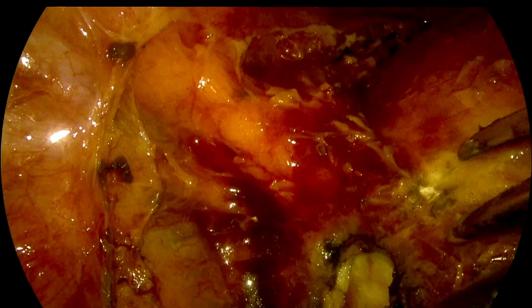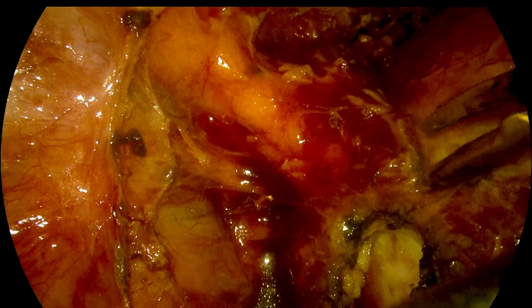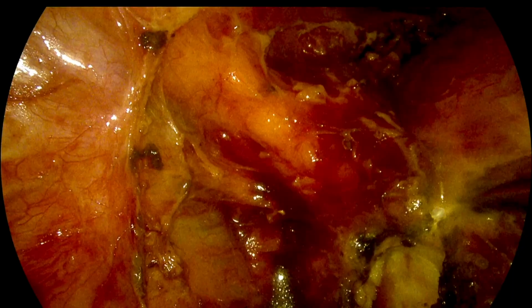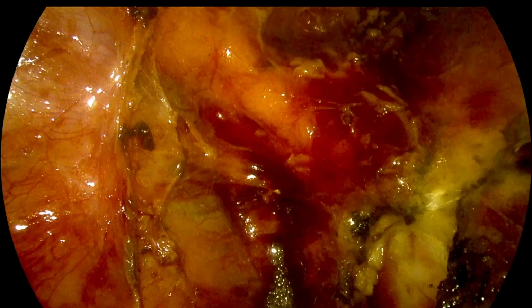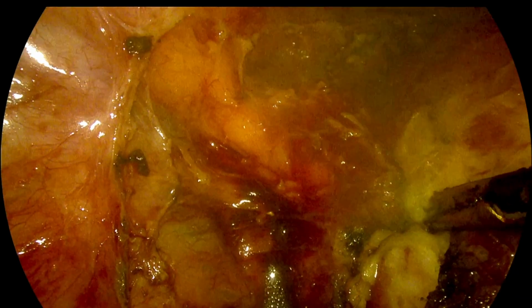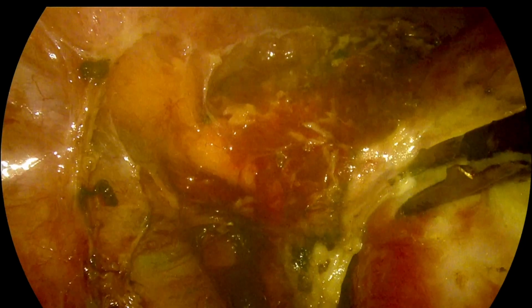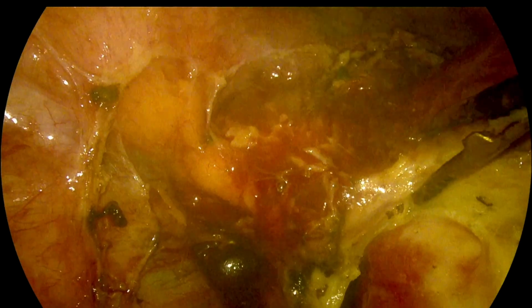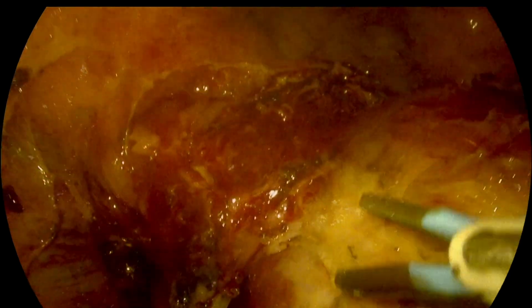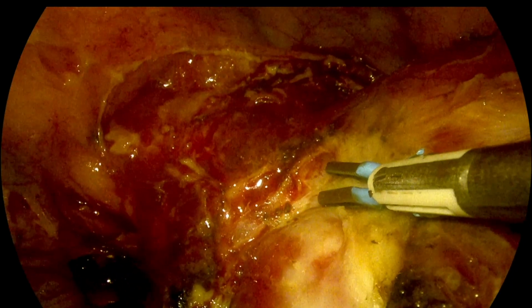So we can see this fat plane is getting separated from the cervix. Now we are reaching the uterine veins. We should be careful, coagulating more than dividing them. Slowly we are continuing our dissection on the left side near the isthmus. Now we have come very close to the site of the uterine vessels.